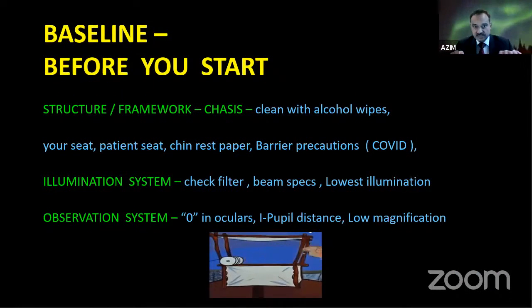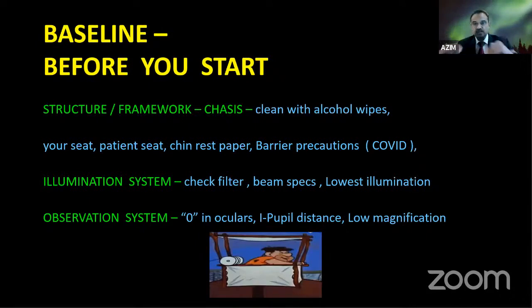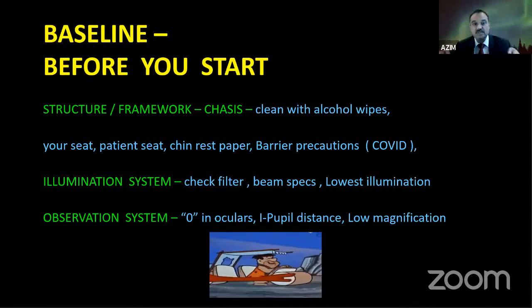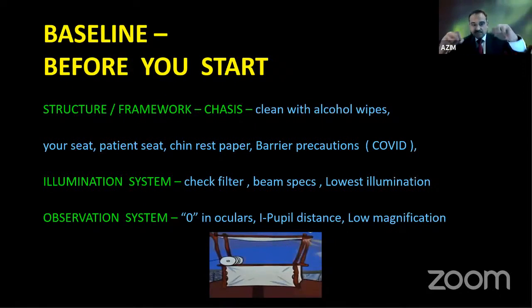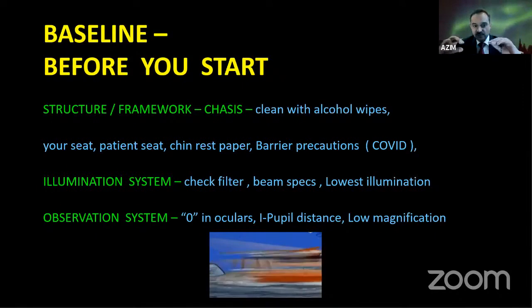Make sure the instrument is clean between patients. Make sure your seat is comfortable. Make sure the patient's seat is comfortable. A small tip, try to avoid using chairs with wheels for the patient chair, because there have been instances, especially with obese patients, when they try to sit down, the wheel tends to move. So it's better to have a chair which is fixed.